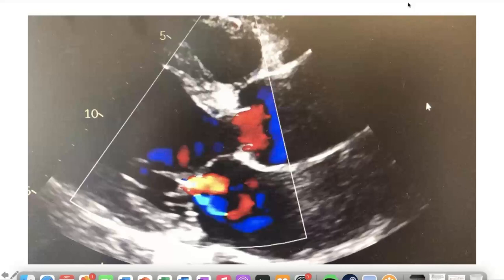And just to answer Anna's question, everyone who we want to then go for surgical intervention, when you think it's going to change the management, should get a CT or an MRI. Echo is not accurate enough because of the limitation with acoustic windows, as opposed to having a proper 3D reconstruction technique. Here, what we generally do is, if it's a younger person, we use MR because we avoid radiation. But if they've had CTs, then we generally use CTs in a sequential fashion, so that then we can monitor the progression, in particular of the aorta, and then use that for surgical planning.